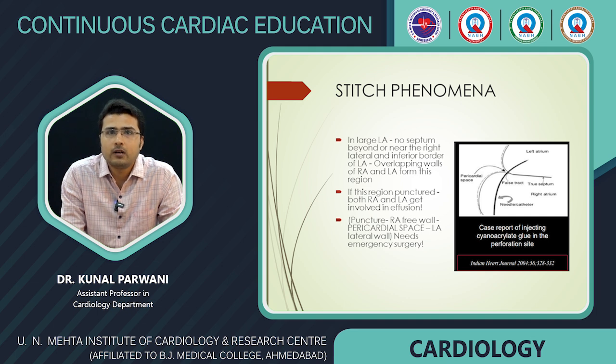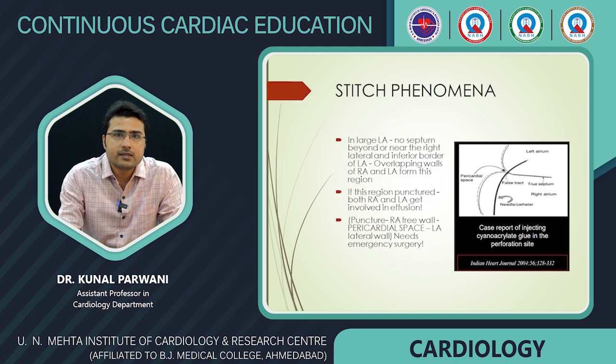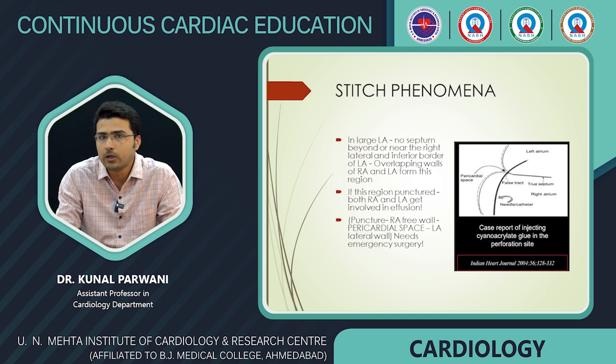It is suspected in fluoroscopy by usually a low or high posterior puncture. Still, the patient may remain hemodynamically stable, and unless the catheter or the sheath is withdrawn, the patient might be totally hemodynamically stable. If one recognizes the stitch puncture during the intervention, one may complete the intended procedure if feasible.